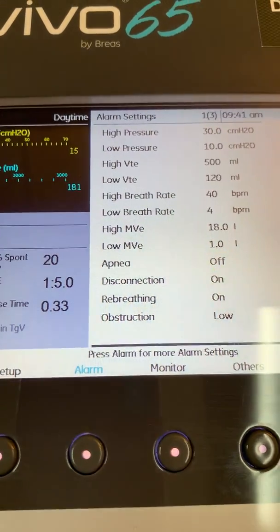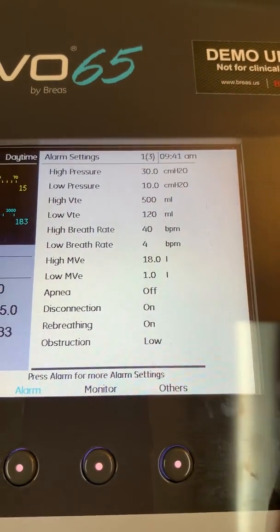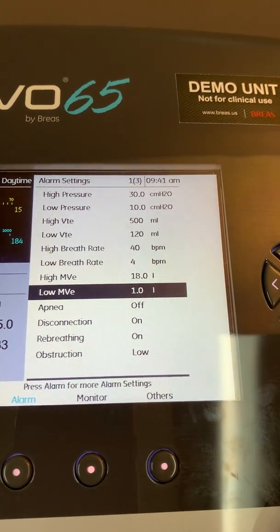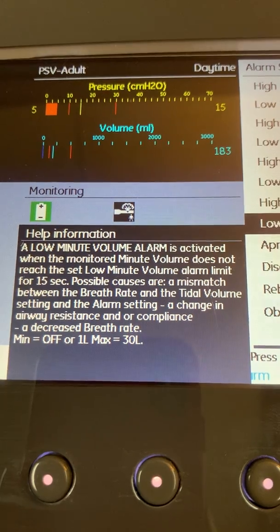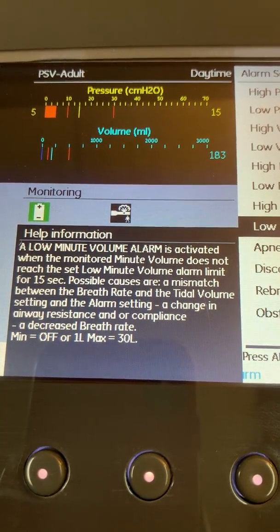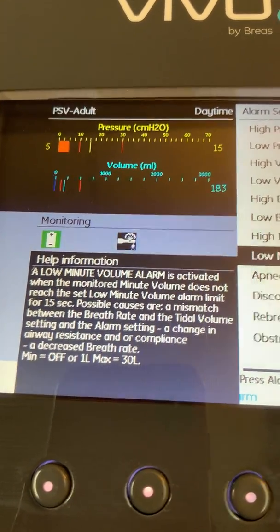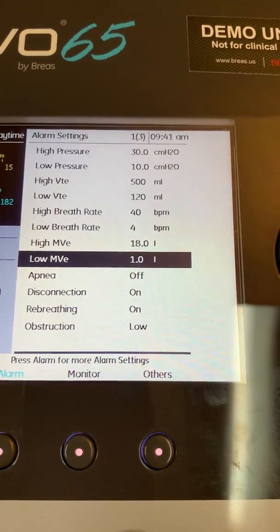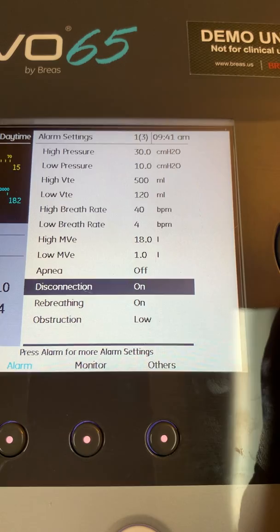Hitting the alarm button again takes you back to page one. One thing I do want to mention is that the information button also works here. If you have any questions about an alarm appearing on the screen, simply highlight that alarm, hit the eye button, and it will give you a definition of what that alarm is, how it's activated, as well as the minimum and maximum settings for that alarm. It's a very popular button and an easy way to understand how each alarm is activated.